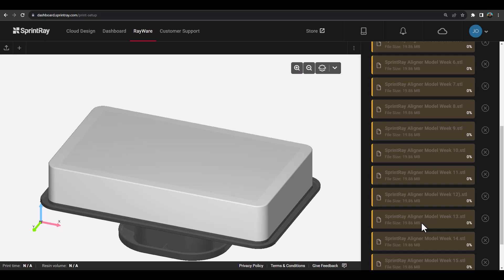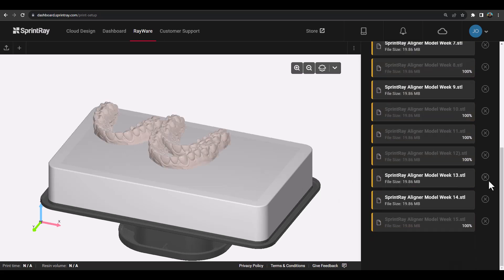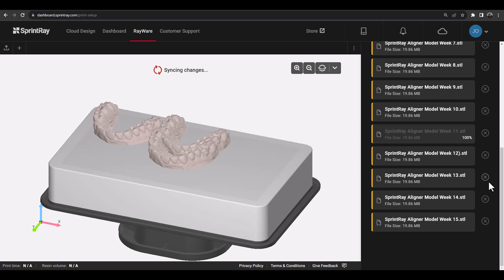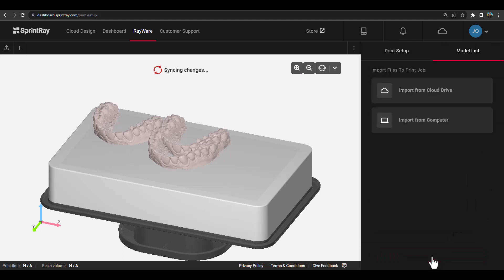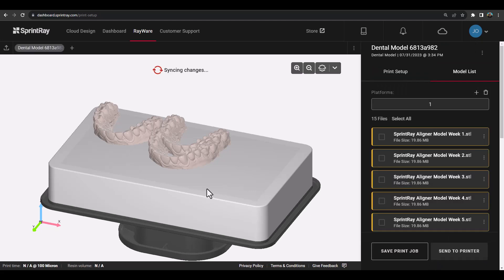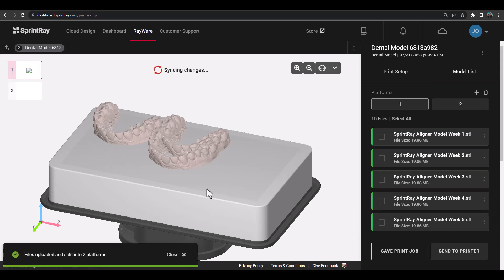In this example, we have uploaded 15 aligner models to Rayware Cloud using a custom print profile for vertical aligners. Once the models have been uploaded, Rayware will then use its intelligent algorithms to automatically sort the models by week number and create any additional platforms needed if all models cannot fit on a singular platform.